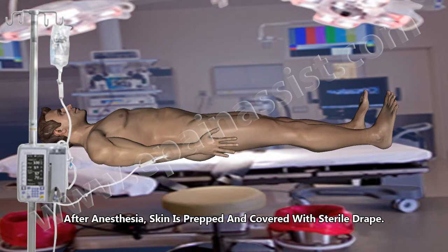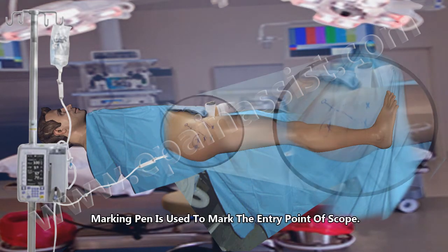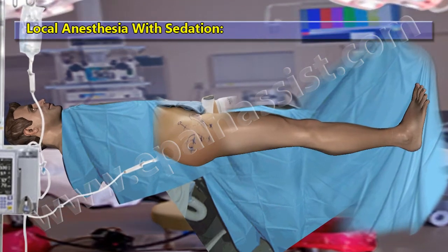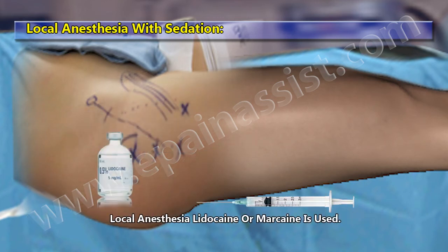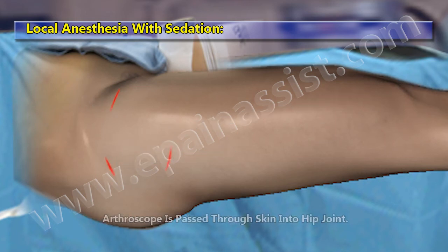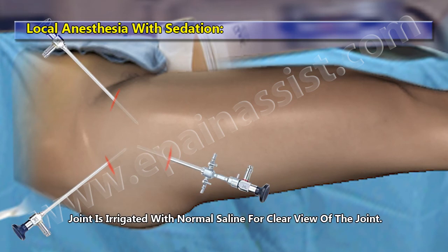After anesthesia, the skin is prepped and covered with a sterile drape. A marking pen is used to mark the entry point of the scope. Skin and soft tissue under the marking point is anesthetized with Lidocaine or Marcaine. A skin incision is made with a sharp knife over the marking area. The arthroscope is passed through the skin into the hip joint. The joint is irrigated with normal saline for a clear view of the joint.